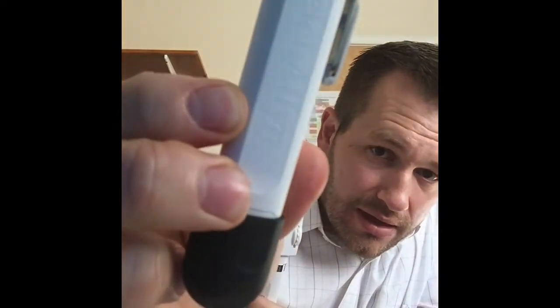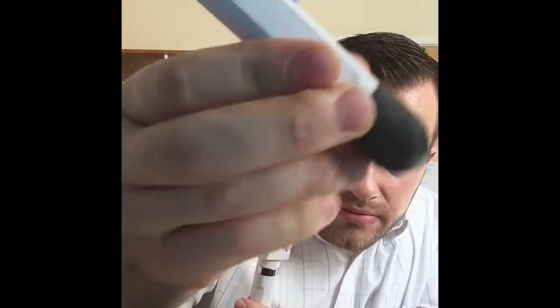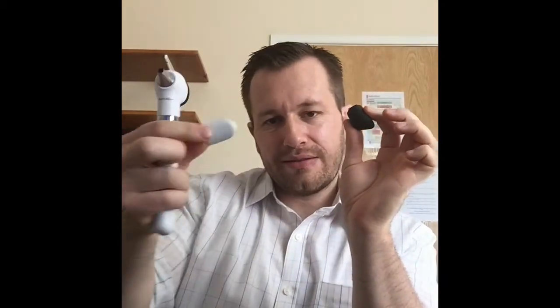So I've got my otoscope here and the ophthalmoscope. I chose the white set and they have a very nice finish to them. They come with handles and you can choose different colors — they've got purple, blue, and white. Because I've got a white one I've chosen to put the black one on the bottom and it holds nicely in your hand, a nice finishing touch.